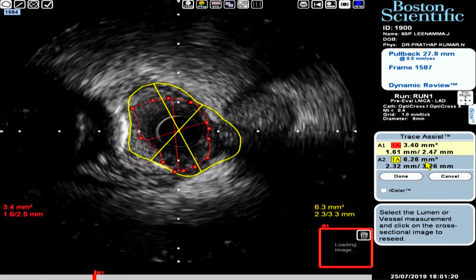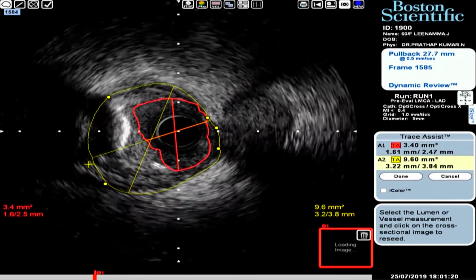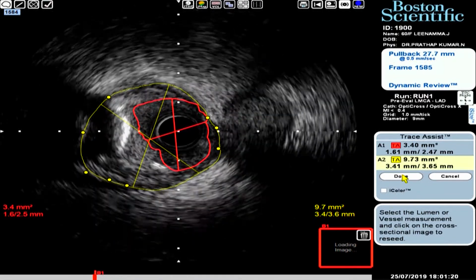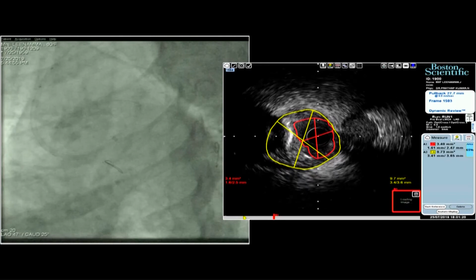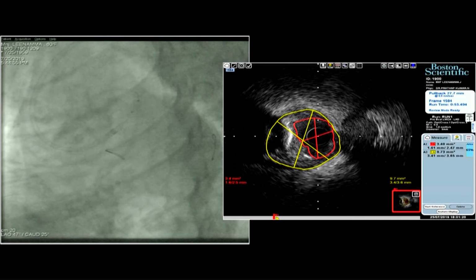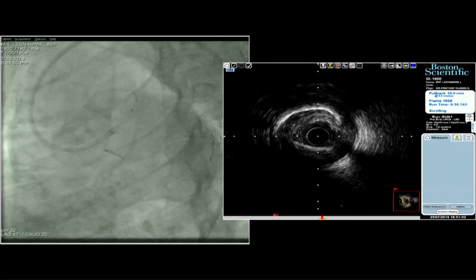Which stent are you planning to take? We will be putting a 3 millimeter stent, 3 into 18 or 24. The proximal portion can be optimized to 3.25 by the IVUS. Okay. We have to take a 3.5 millimeter post-dilatation balloon, 3.5 into 8. When you have to position the 3 millimeter stent exactly at the ostium, a stent like Xience, which has a marker exactly where the stent starts, could have some advantage in this ostial placement.